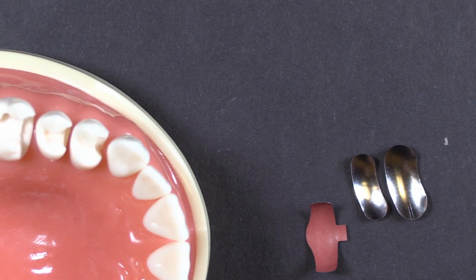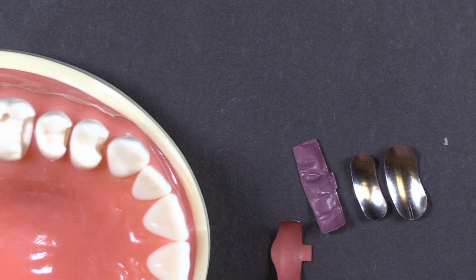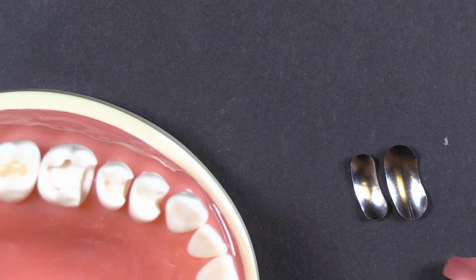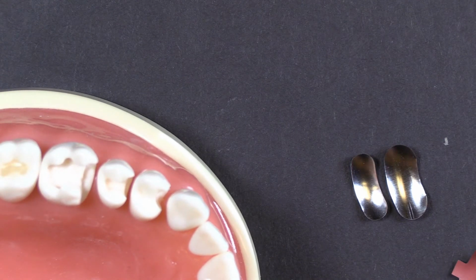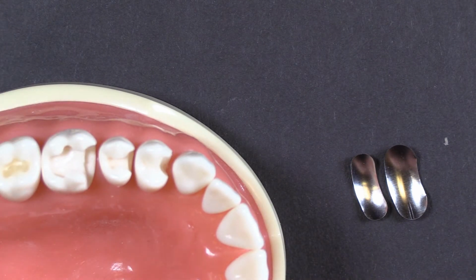And you can see, let me grab one of these. Here, I'll take this purple one that we used on that first little demonstration. I'm going to flatten it out here so that you can see how much longer they are now. Yeah, so squashed flat, it's a lot longer, and it wraps around the tooth a very long ways. And on a smaller tooth, premolar, bicuspid, small molar, when you're doing an MOD, the ends of those bands can start to kind of get in the way of each other.